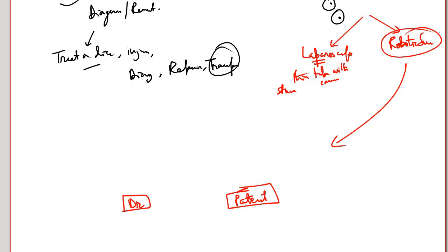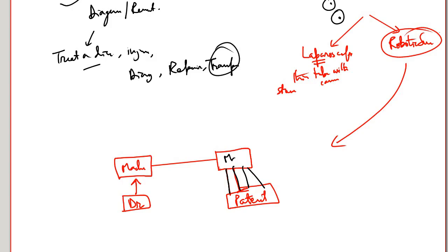What happens is that the doctor operates on a machine, and the machine has another part over here which has arms, a very different type of arms, robotic arms, and these arms perform the operation. So the doctor is like playing a game. Just as when you play on a game console, the doctor is operating the machine, and the machine does the operation.